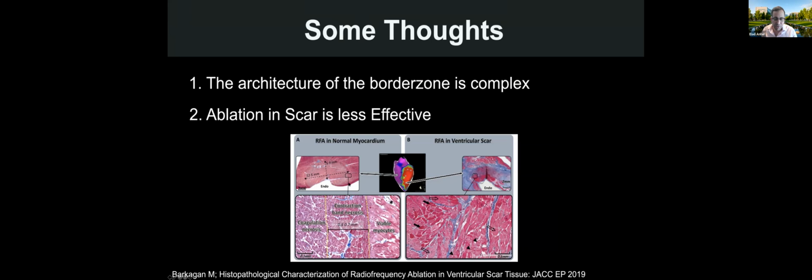Now, the other thing I want to tell you is that I do a lot of catheter evaluations and all that, but this is how we measure lesions. We take a swine ventricle or thigh muscle preparation, whatever it is. We apply time and power and we measure this. And very well demarcated, there are very different histological stages of how a lesion is being created and what the border zone of necrosis is. Now, we've done the same thing on scar, and I gave it to one of my colleagues, Jeff Safit, a well-known pathologist.